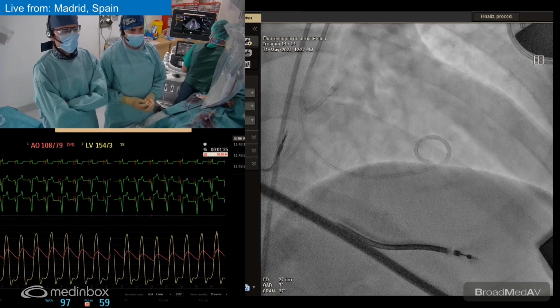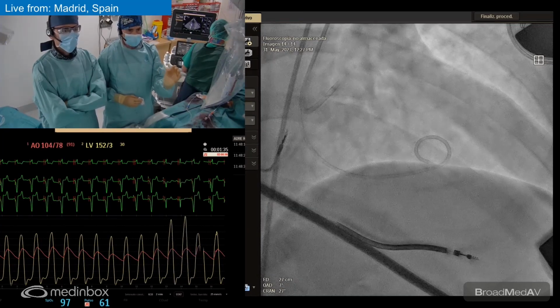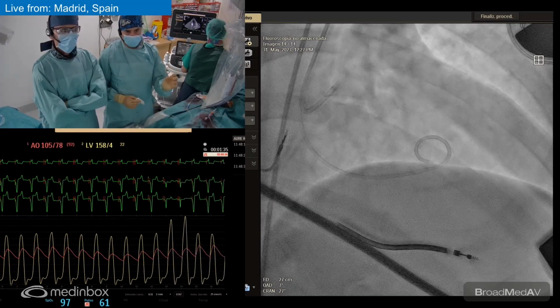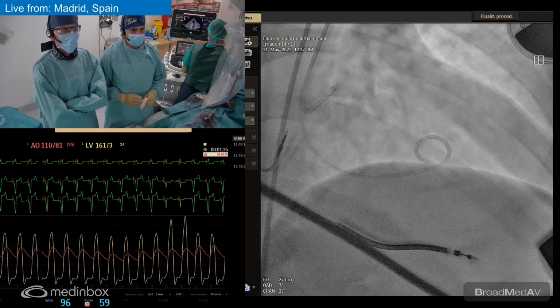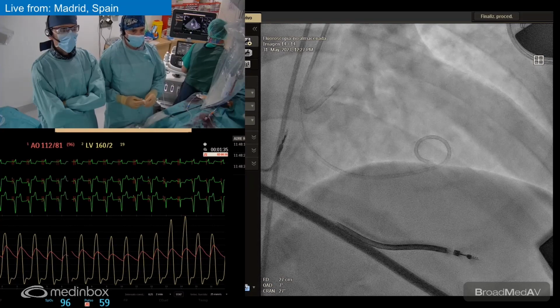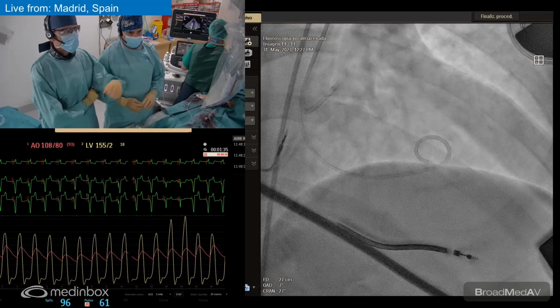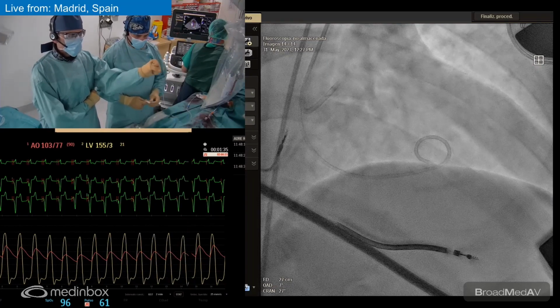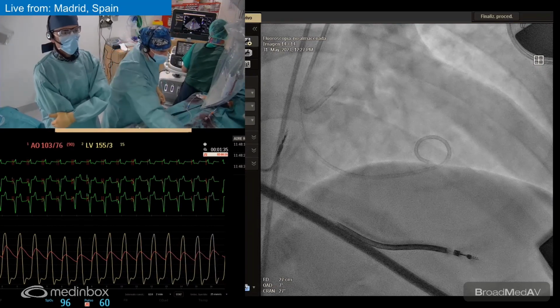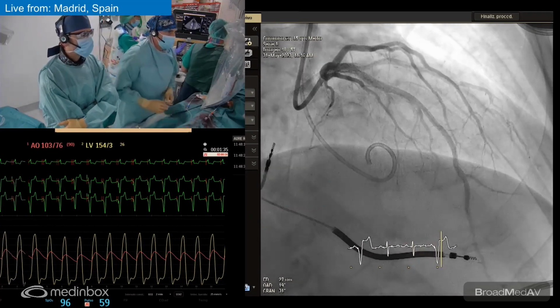the basal gradient. Usually, when you find the accurate septal branch, the effect is very marked, is very clear, and you see a drastic reduction in the gradient. But probably in this patient that has 3 or 4 big septals, we can see also compression of the septal in the myocardium. Probably we need to treat more than one.